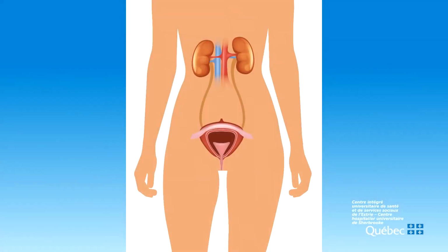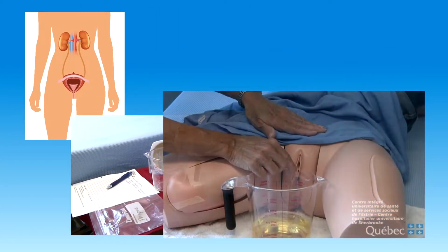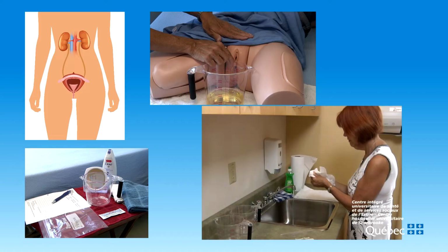I'll begin by describing the urinary system and the anatomy of the genital region. Then, we'll look at the materials needed for self-catheterization, and I'll explain how to perform the procedure so that you can do it by yourself at home. I'll also show you how to care for your catheters, and just a reminder, all the information in this video can also be found in the guide that you will receive.